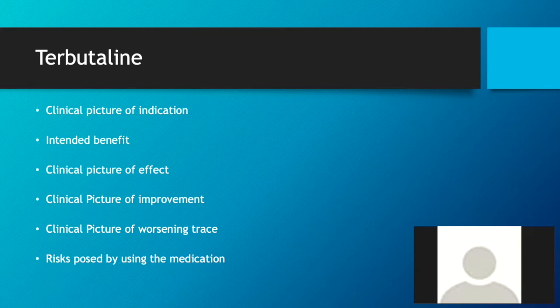Now, the intended benefit is that the uterine contractions are going to settle to try and improve the baby's condition. So the first response I'm going to see is that, or at the same.